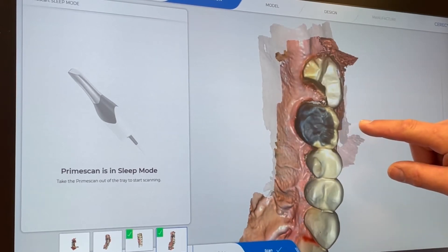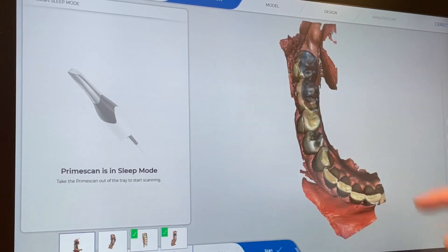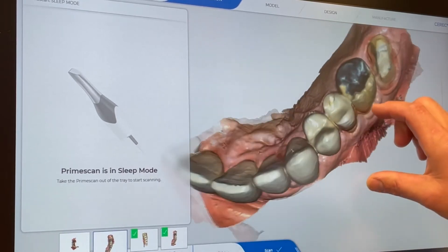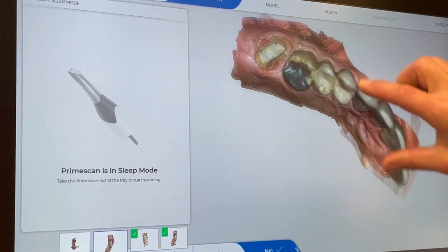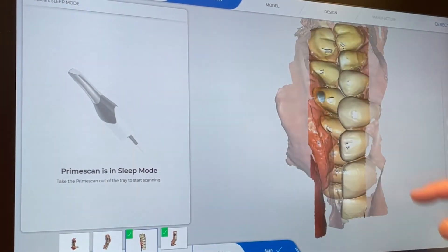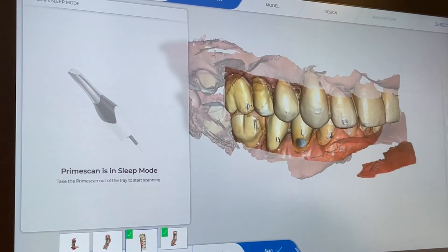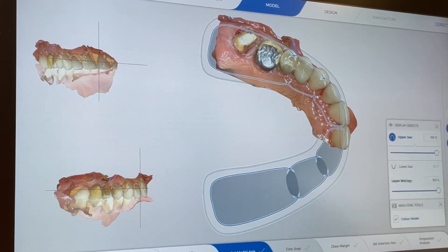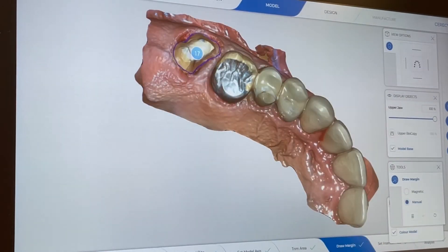Here we have the upper arch and that's our prep tooth. You can see how damaged it was — it basically came in as a broken tooth, and this is our catalog of the preparation that we did. The break was a little bit extensive on the distal. There is our buccal bite. So now we have our upper, lower, and our bite, and we move on to checking the axis of insertion.